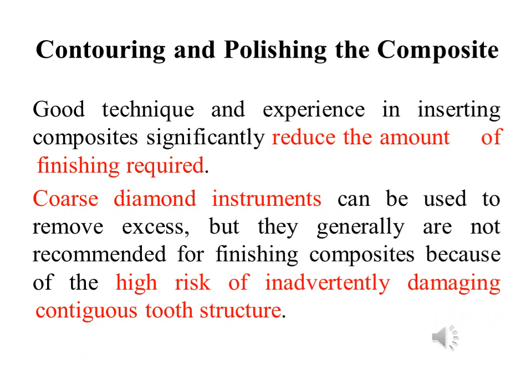Contouring, finishing, and polishing of the composite restoration. During the application of composite inside the cavity, we need good technique and experience in insertion of composite, so that we reduce the amount of excess material and the time for finishing and polishing.